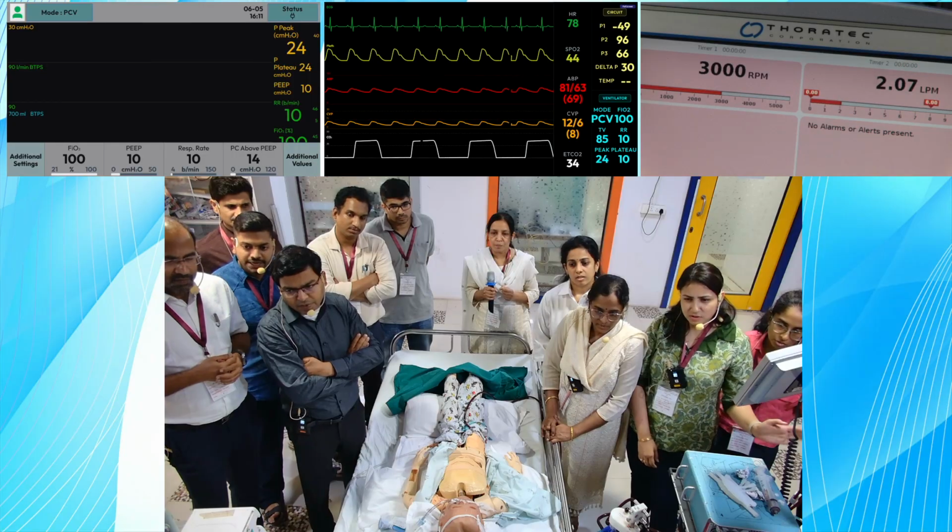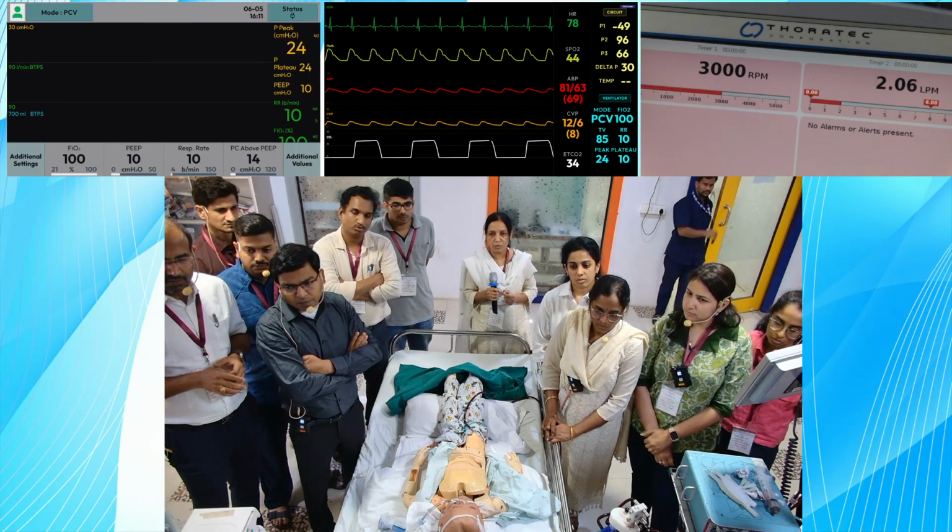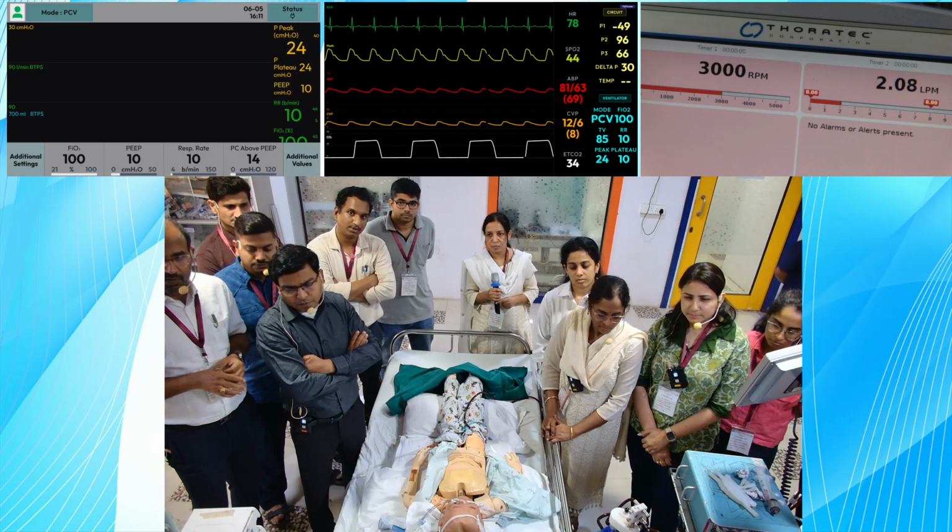So for the blender, what have you done? We have changed the pressure to the blender, increased the oxygen to 100%, and changed the oxygen cylinder. Did it help? No, sir. It is worsening. The patient is going into bradycardia.